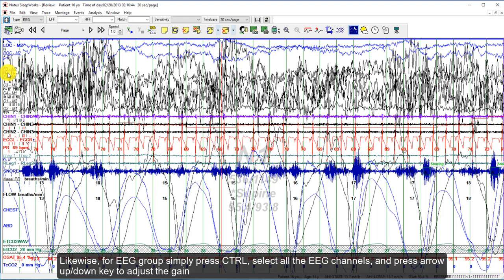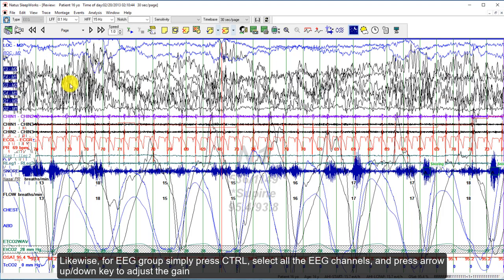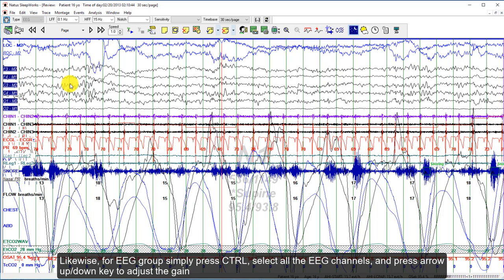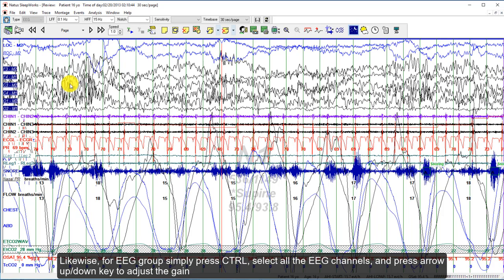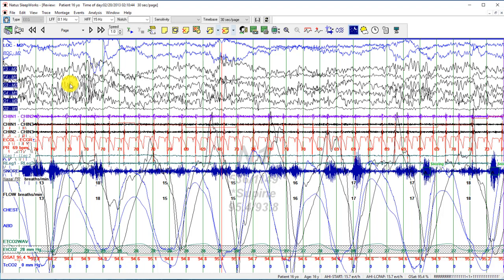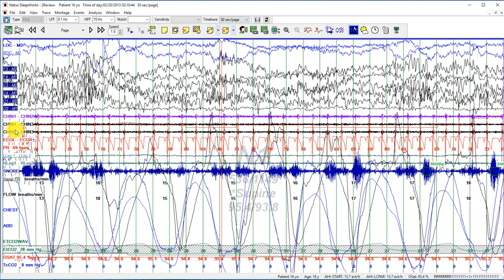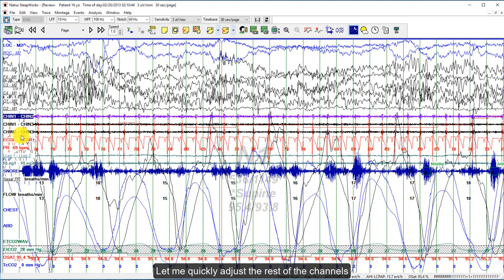Likewise, for the EEG group, simply press Ctrl and select all the EEG channels. Then press the arrow up or down key to adjust the gain. Let me quickly adjust the rest of the channels.